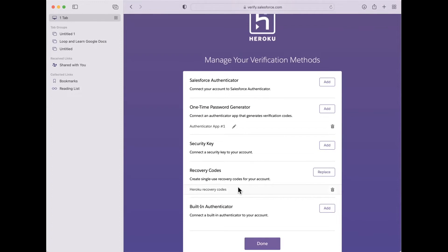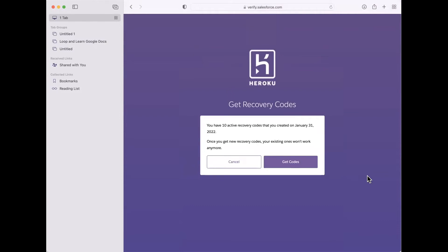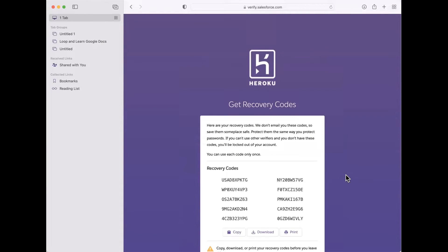You're going to first want to get recovery codes. This is in order to make sure that if you have a problem with your authenticator, you will be able to get back in. I have 'replace' here because I've already done this, but I will do it again to show you. You click here, then click on get codes.